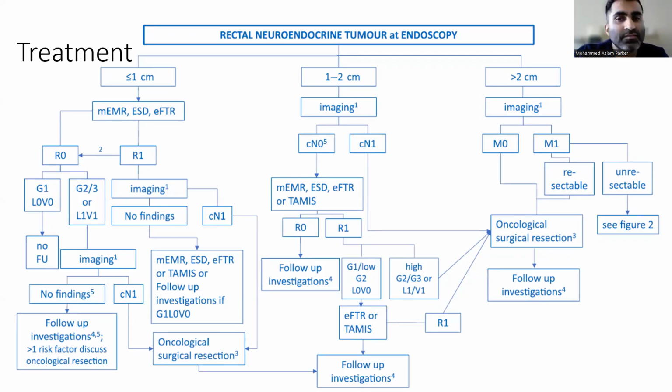So from a practical point, EUS is recommended, but not many have access to rectal EUS and radial EUS. So essentially for local staging, rectal EUS versus MRI. For distant disease, it would be MRI or PET CT.